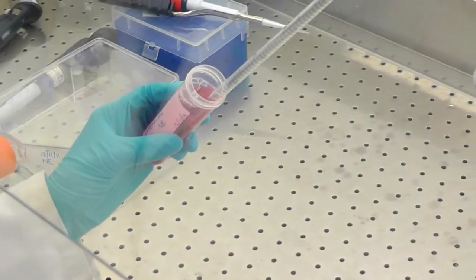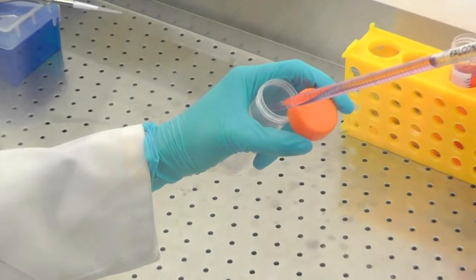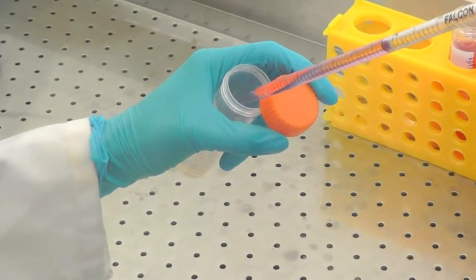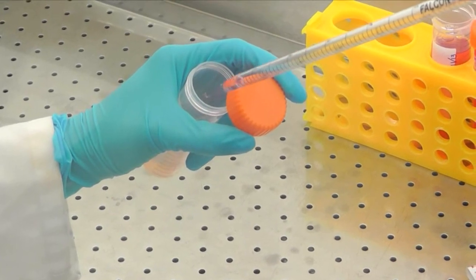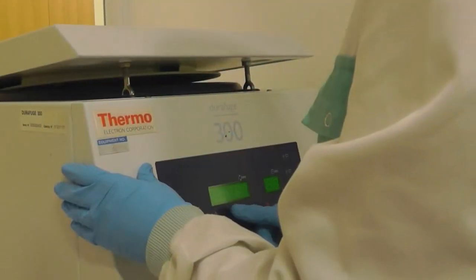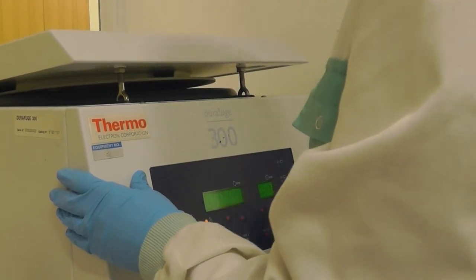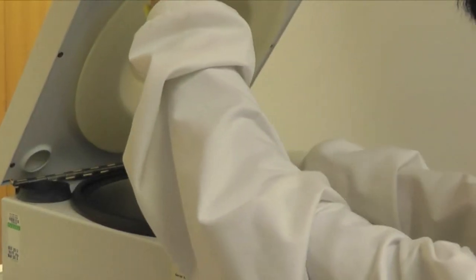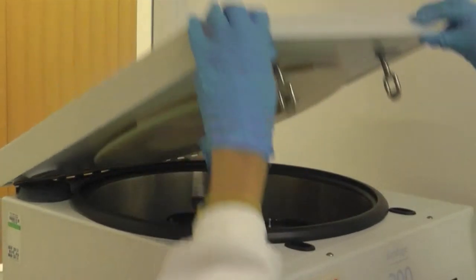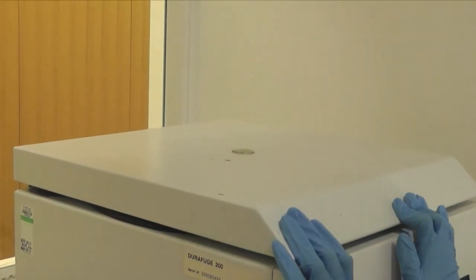To inactivate the TrypLE Express, an equal volume of media can simply be added to the cell solution to dilute the enzyme. If using trypsin, it will be important to add media containing serum in order to inactivate the enzyme. The tube is centrifuged at 100 G to form a cell pellet at the bottom of the tube. Most centrifuges only have settings for speed in revolutions per minute or RPM, so the RPM setting you use will be dependent upon the centrifuge model and the rotor used.